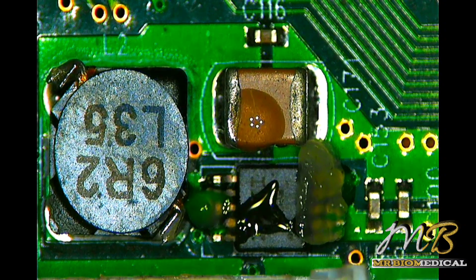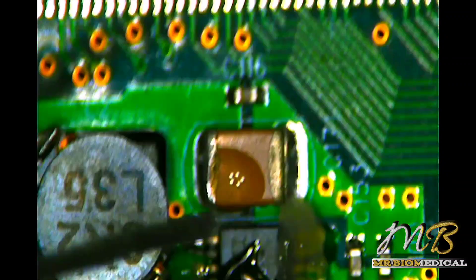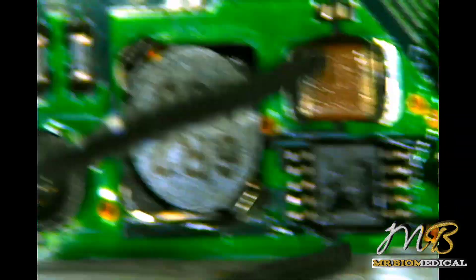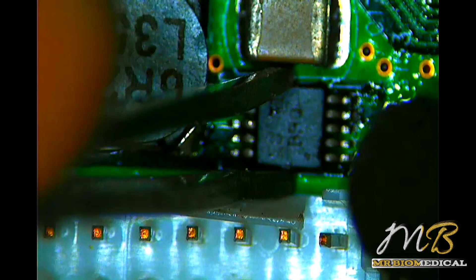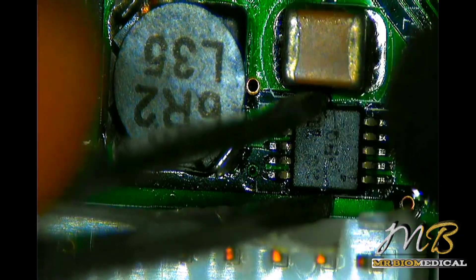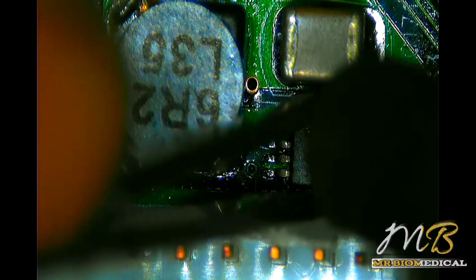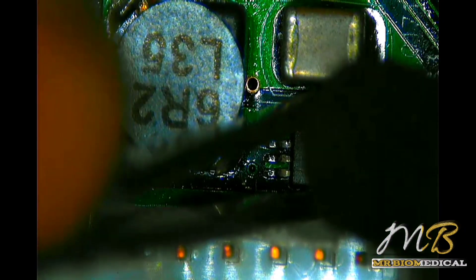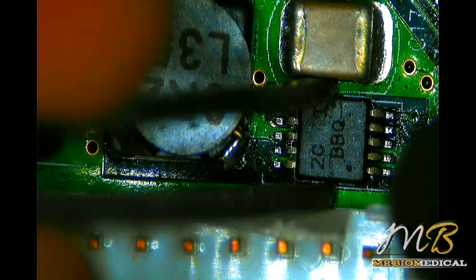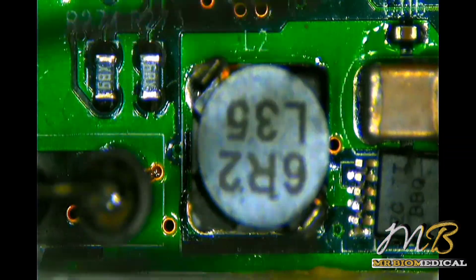Be careful around nearby components and connectors because they are plastic and will melt if overheated. Don't apply too much pressure on any IC, caps, resistors, or anything else — you should go with the flow. Heat is fine, but excess pressure may break the pads and then you will have to rebuild them. I am working at 450 degrees Celsius, which is good enough.